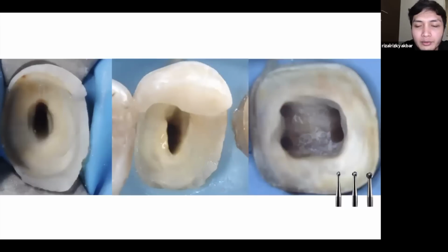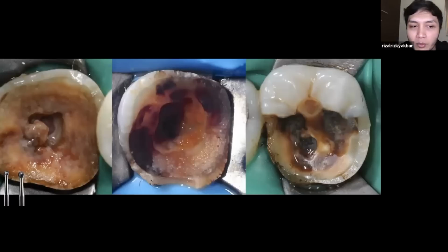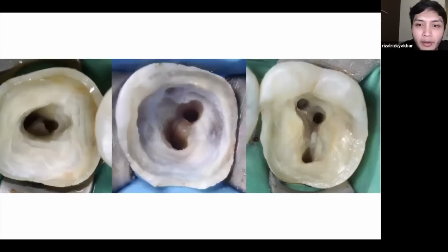As you can see here, it's very clean, and I would like to recommend this for everyone to use carbide, to have it. I have every form of carbide, so I can use it in many ways.